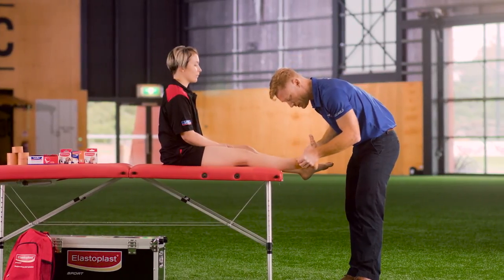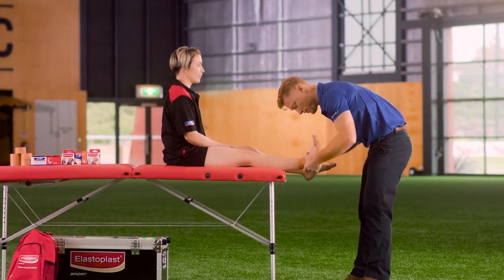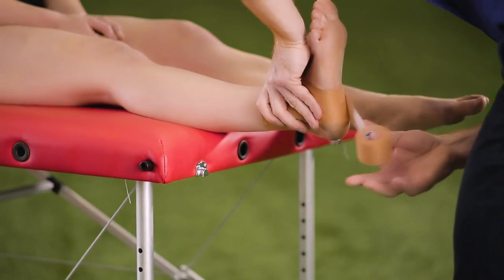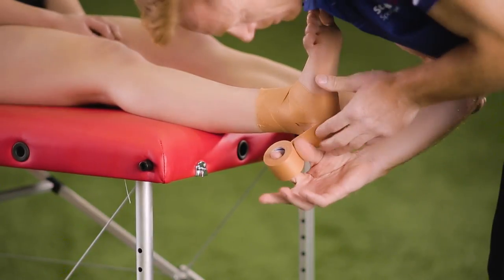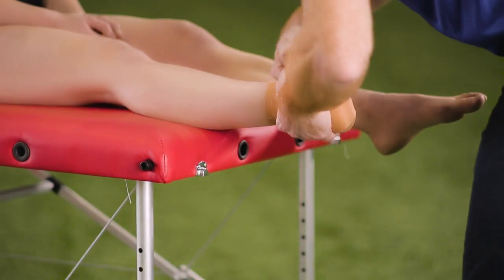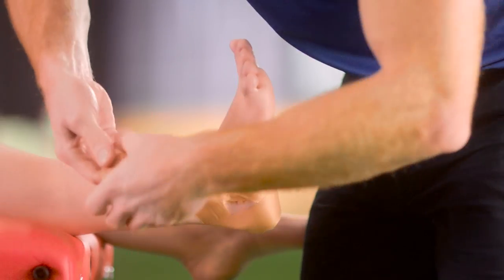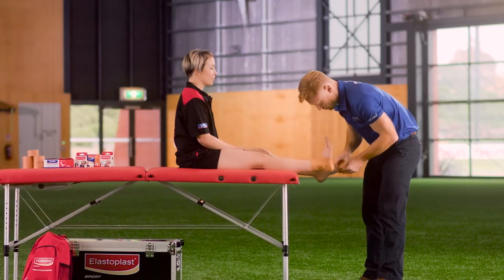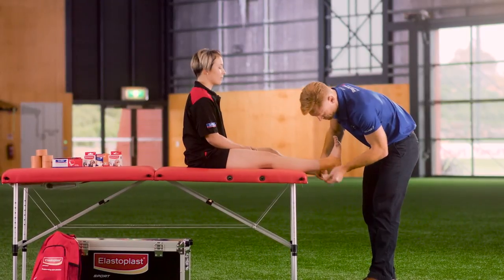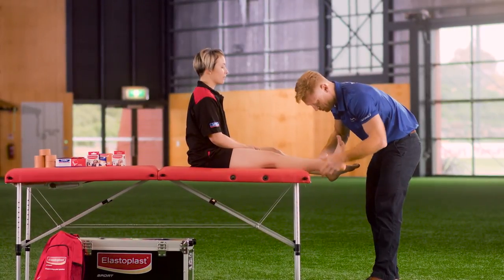We can repeat this procedure on the other side to add more support, coming underneath following the tape line, across the heel, and back over to the outside or lateral aspect of the ankle and calf. We finish off the procedure by repeating an anchor just above or superior to the ankle.